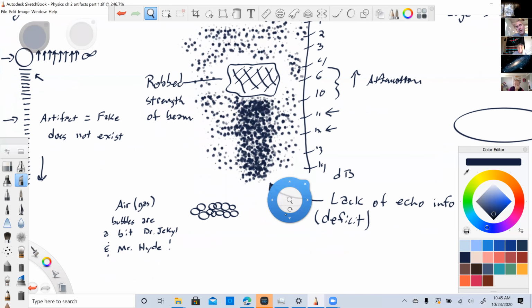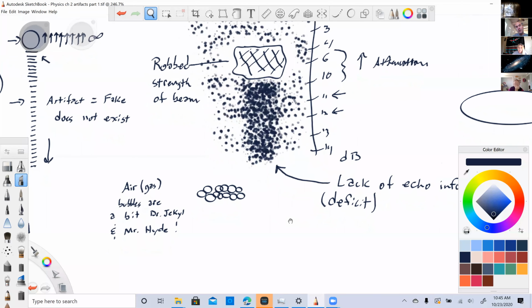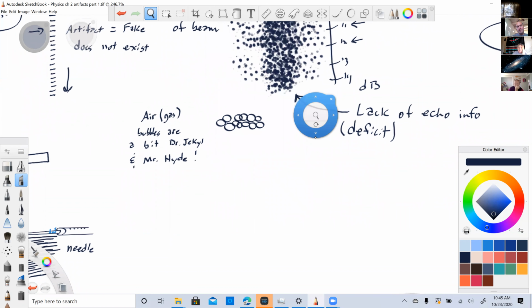And this could be, by the way, one of the major things we look for in breast cancer. For some reason, breast cancer tends to shadow. So you'll see something that looks like a tumor and there's a dark shadow underneath it. It's a bad sign. And the opposite is also true. If it doesn't shadow at all, that's a good sign.